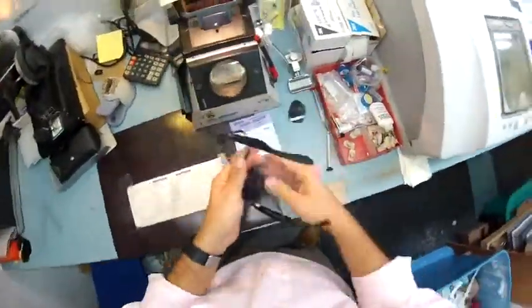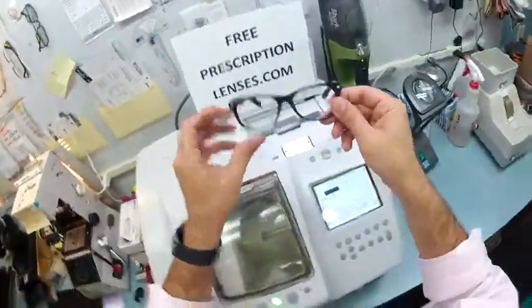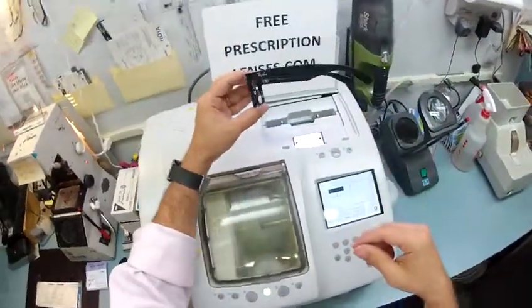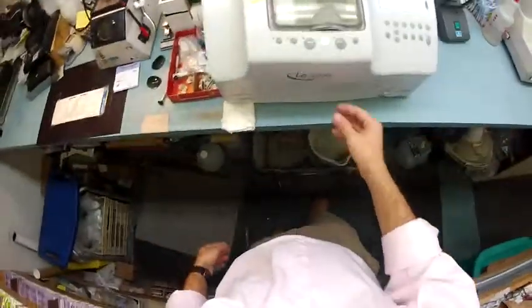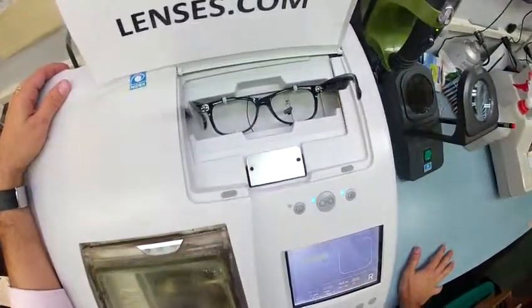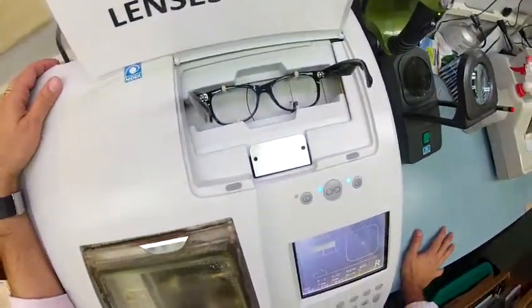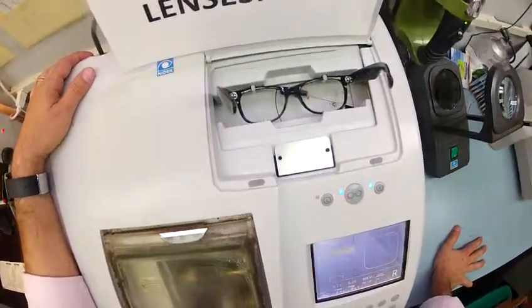I'm going to pop out your original heavy glass lenses from the frame, and your frame is now going to weigh about half or even a third of its original weight. I'm going to put your frame into my Nidek LE 1000 patternless edger, and the stylus is going to trace the shape of the right lens, then move over and trace the shape of the left lens.